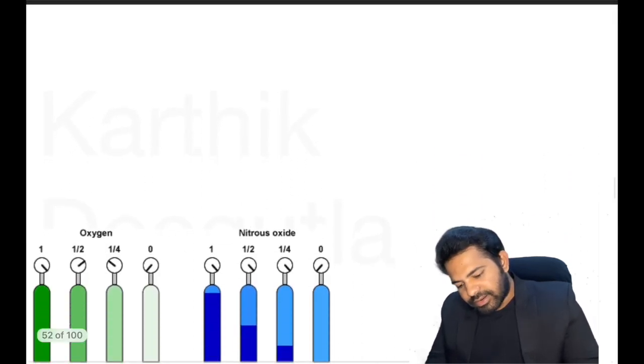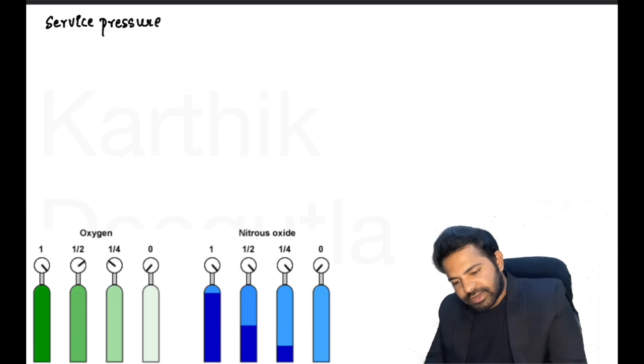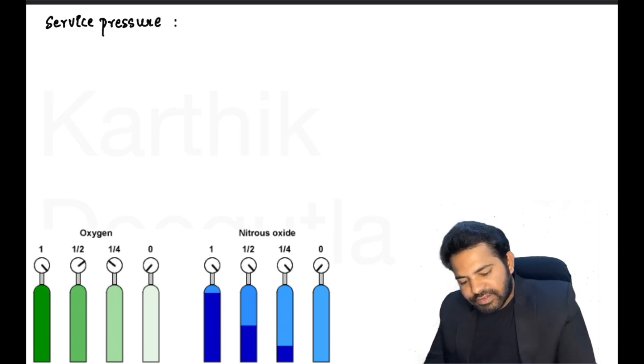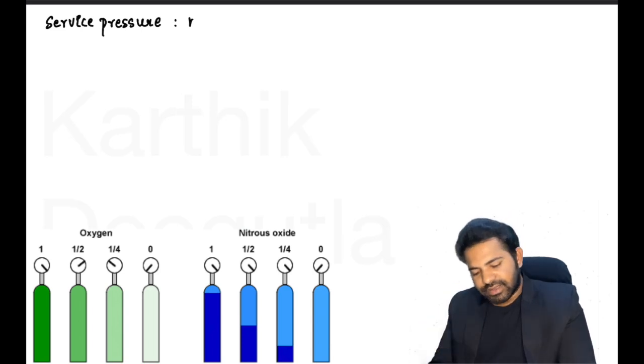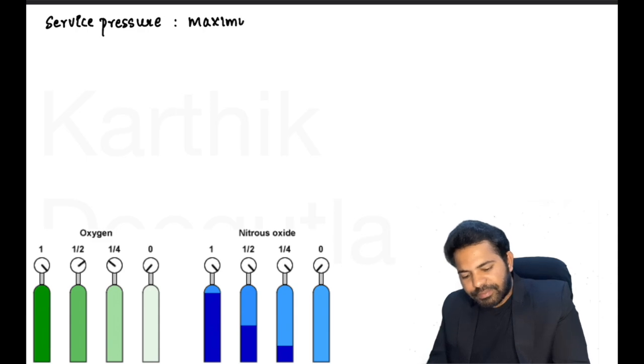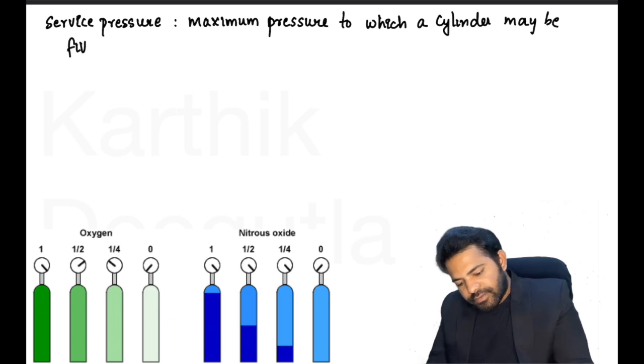Now moving on, let us know what is service pressure. The service pressure is the maximum pressure to which a cylinder may be filled at 70 degrees Fahrenheit.